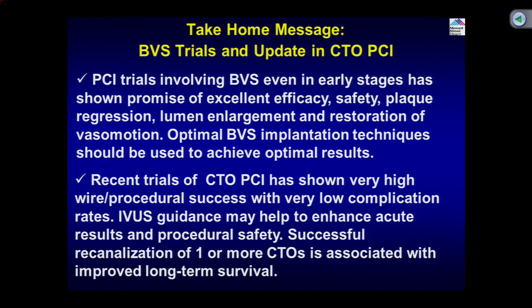Second, the recent trials of CTO PCI have shown very high wire as well as procedural success with very low complication rates. IVUS guidance may help to enhance acute results and procedural safety. Successful recanalization of one or more CTOs is associated with improved long-term survival. So the goal should be not to just attempt the CTO, but to succeed in opening the CTO.